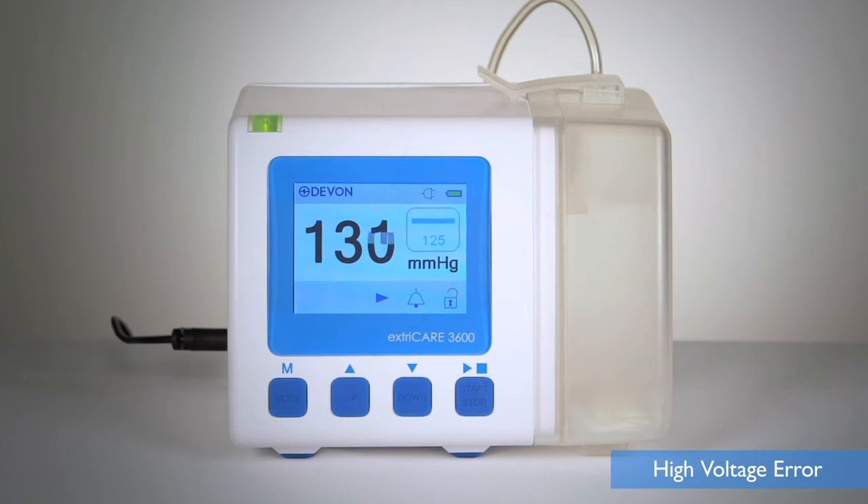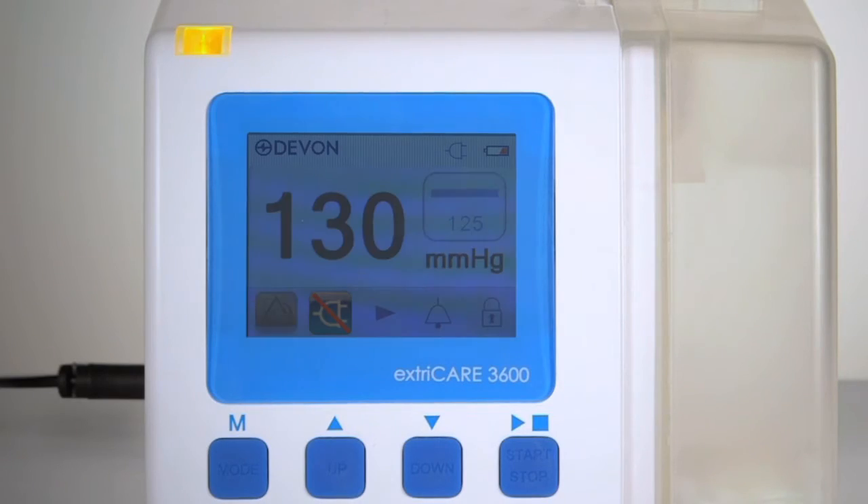The high voltage error alarm will sound when the input voltage is greater than 16 volts, when the device is being used with an adapter that is not recommended. The LED light will flash yellow and the adapter error symbol will appear on screen until the correct adapter is used. Failure to use the correct adapter may cause the fuse to blow out.